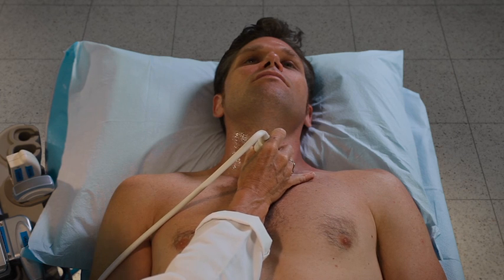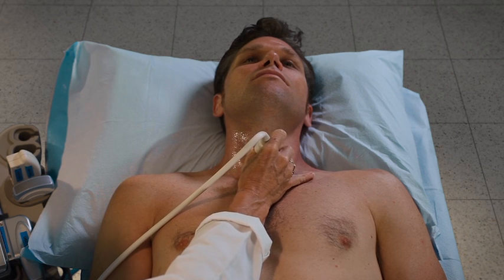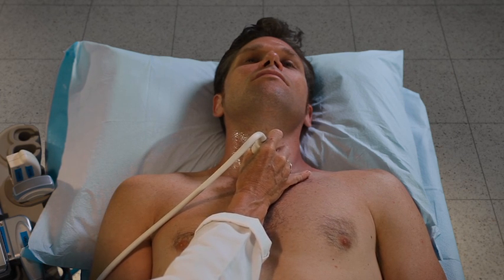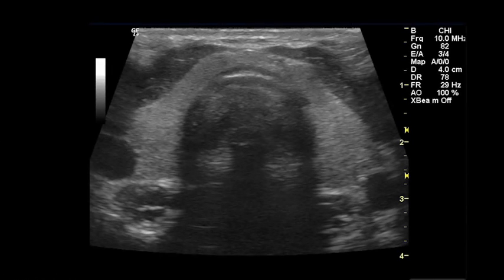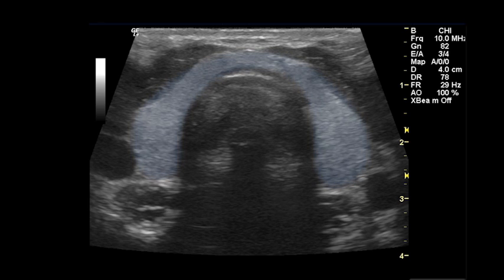Place the probe on the anterior surface of the neck between the larynx and the suprasternal notch. Adjust the position of the probe so that the thyroid is in the center of the screen. Note the homogeneous echo texture of the normal thyroid gland.